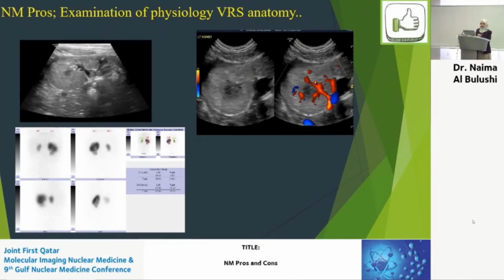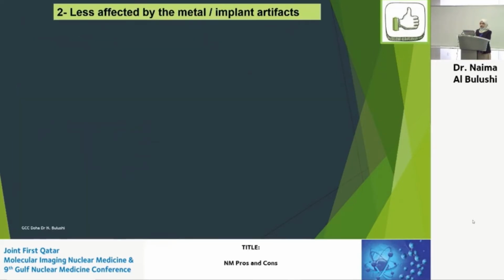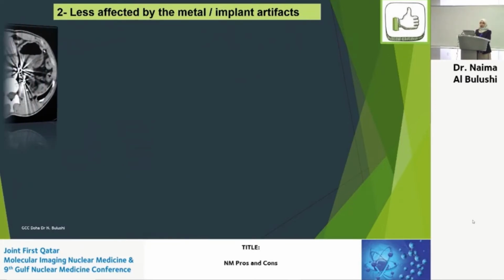And this is not a tumor, because if it were a tumor, it wouldn't show any DMSA uptake. It would be photopenic, meaning that this is a normal variant, or what we call hypertrophy of the column of Bertin, which is part of the renal tissue itself. It is not a tumor, and it's a big relief for the physician, the pediatrician, as well as the family.